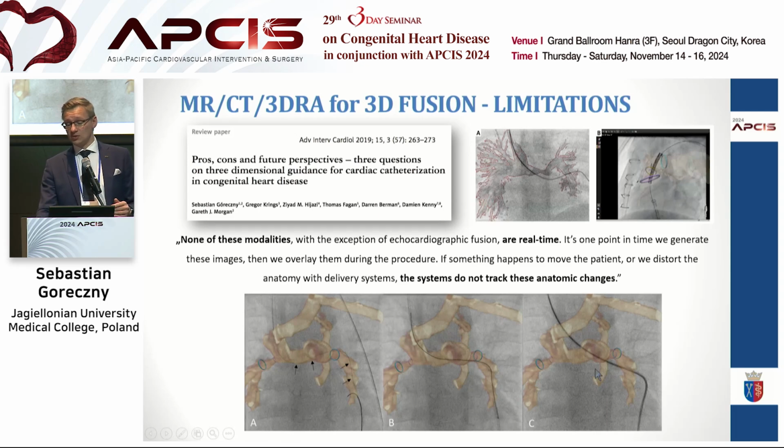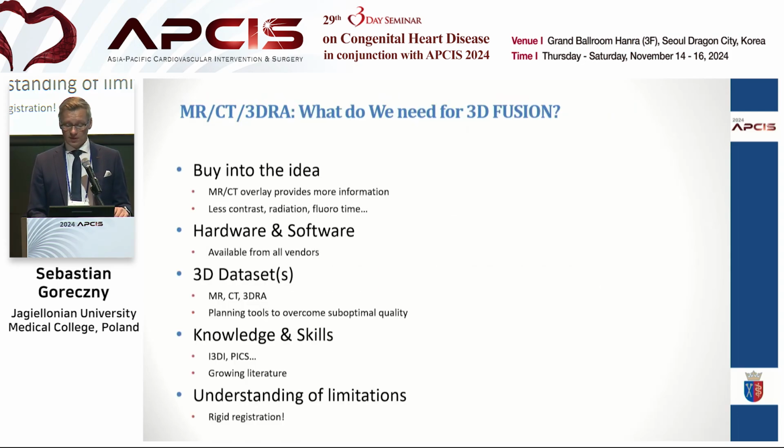So my colleague used this wire, and then he told me, oh, it doesn't work. Of course it doesn't work, because this CT was performed without a wire inside. And during the case, you introduced a stiff wire, so you're going to change anatomy. So this is the key limitation of that technology.